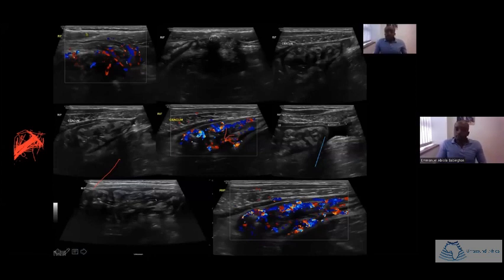We saw a large appendicolith, and the base of the appendix is normal, but we didn't see much of the rest of the appendix. However, this cecum was bulky, you see here, and that's another cecum image there. And you can see the fine vascularity is quite increased. It looks beautiful, but very painful for the patient, unfortunately. It looks very well defined on ultrasound.